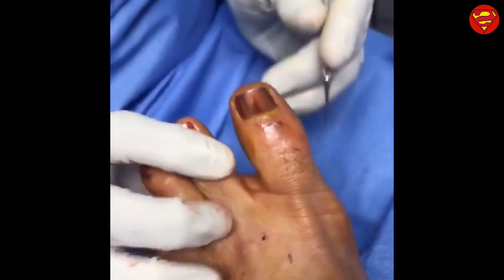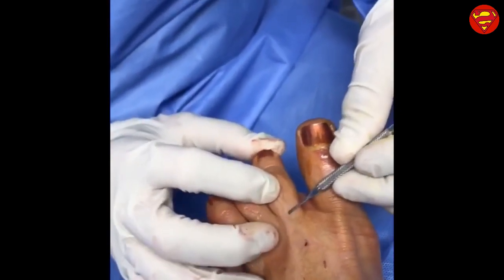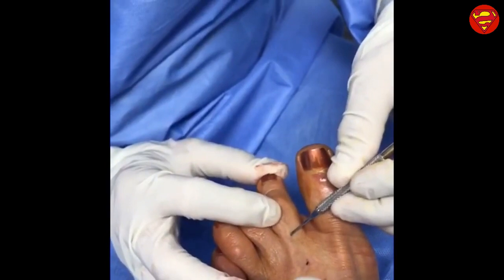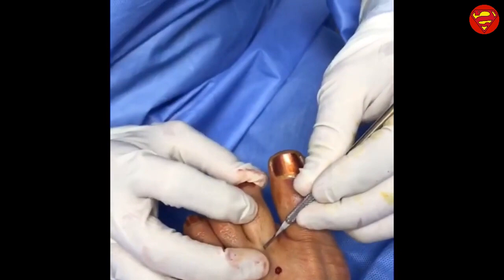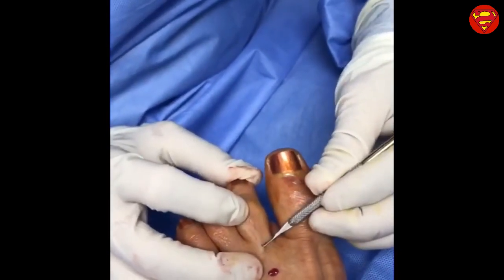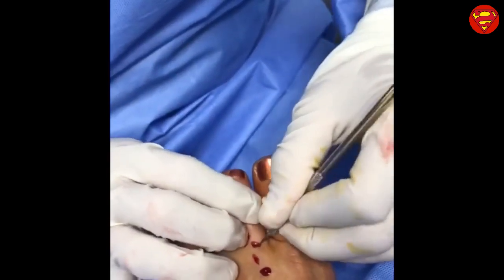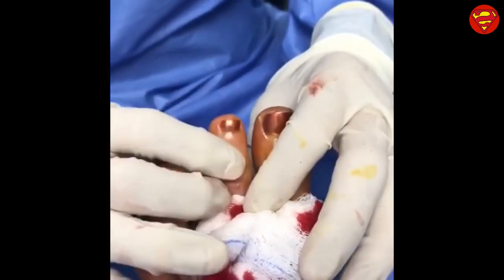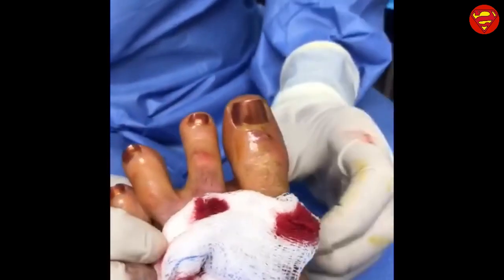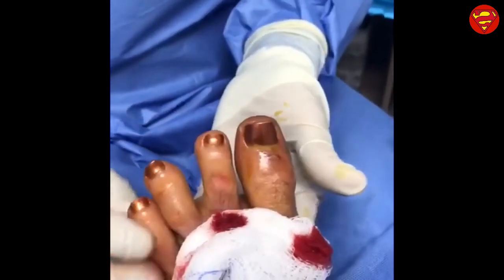When we talk about incisions, I don't even know where my finger is, but there it is. You don't even need a stitch there. But you guys are going to see how, I mean, going to Disney World, there's magic, but this is better than Disney World. So we're loosening up the soft tissue structures, and as everyone can see, the toe is already straight. We're trying to get that toe into a more rectus, straight position.